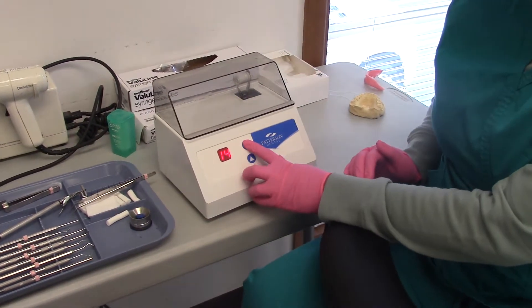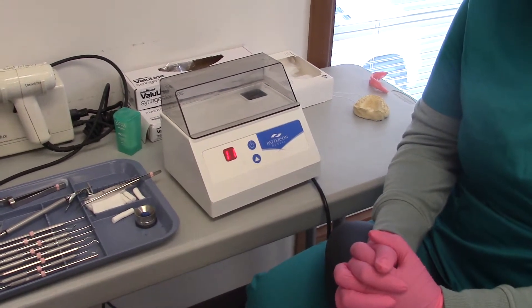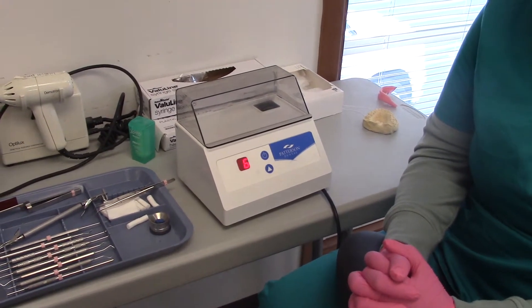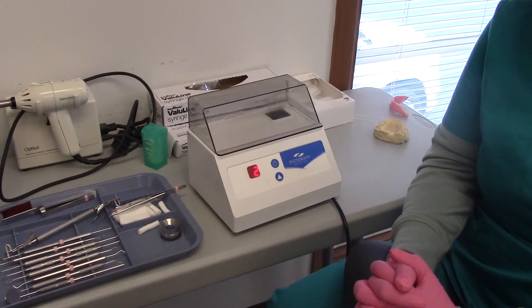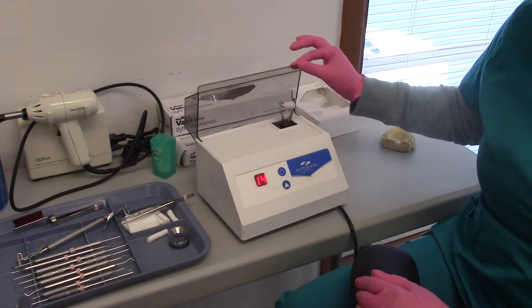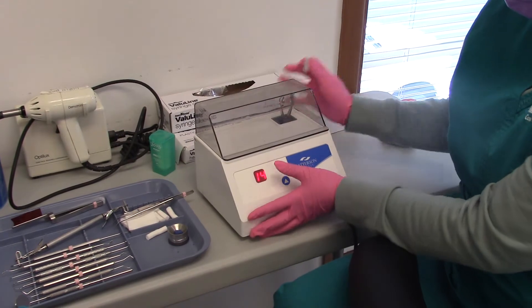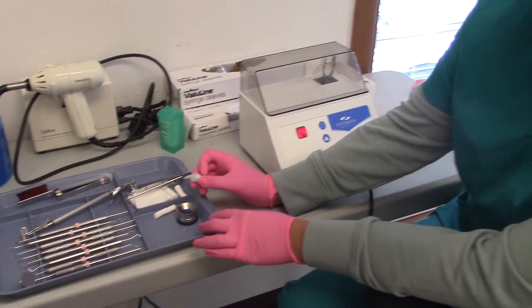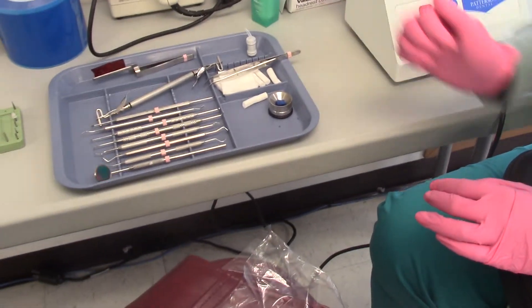Cut this and turn it on — mixing the amalgam. Actually, we're putting the amalgam in, but we're using Play-Doh for pretend.